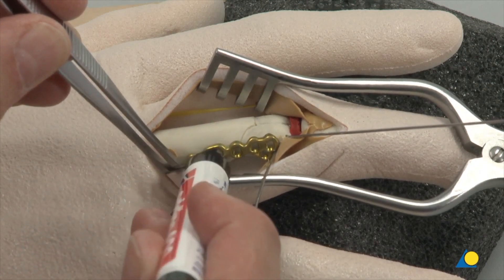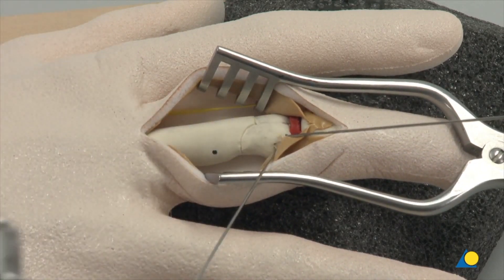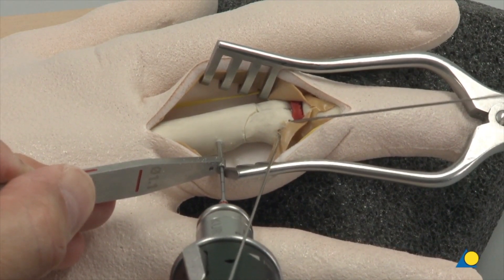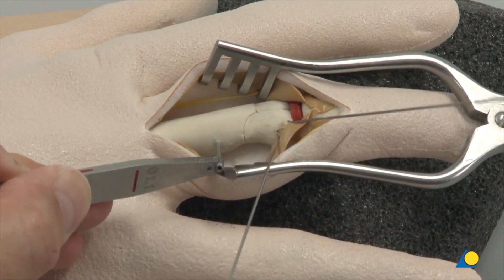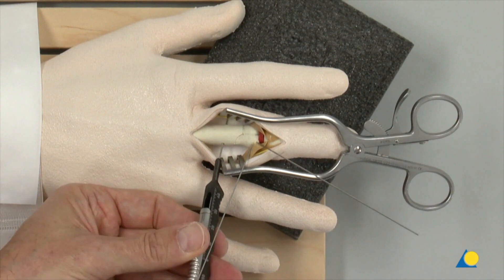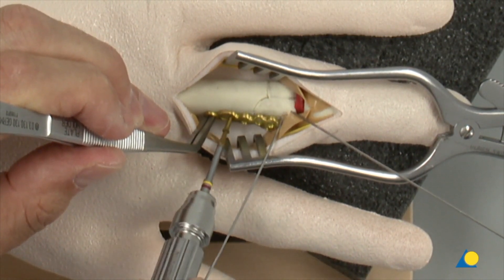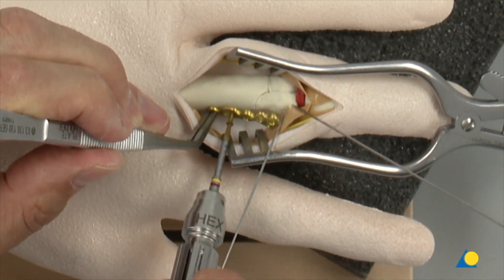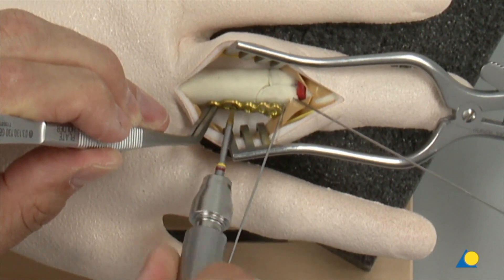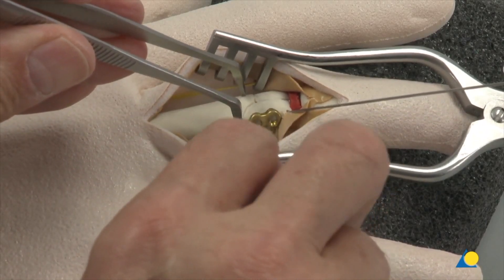The first hole is marked on the bone through the elongated plate hole. The hole is drilled using the 1.1 mm drill bit and the 1.1 double drill sleeve. The depth is measured and the first cortex screw is inserted. The plate is provisionally secured to the lateral side of the phalanx. The screw is not fully tightened in order to allow for subsequent plate adjustment. After the plate has been adjusted, the screw is fully tightened.